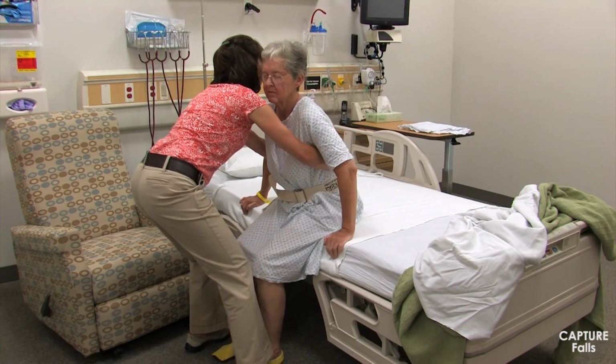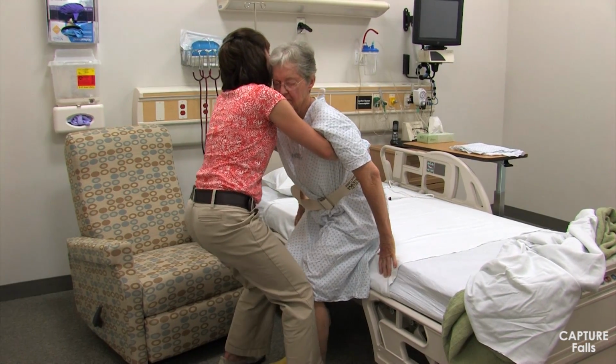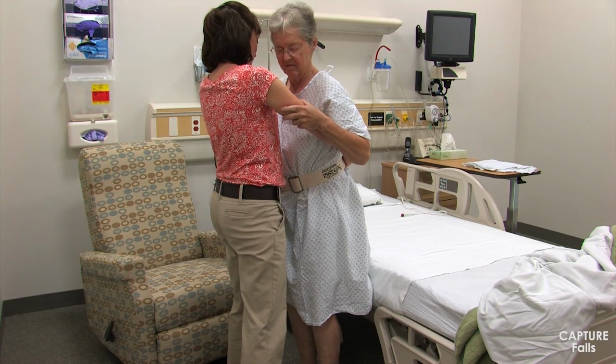Next, you'll see how I'm using the belt to assist the patient into standing. The patient must lean forward to shift her center of mass over her base of support, which is in this case her feet, as she stands. I'm using the gait belt to guide the patient's center of mass forward. I'm not pulling straight up on the belt. Rather, I'm using it to help direct the patient forward and up on a diagonal.